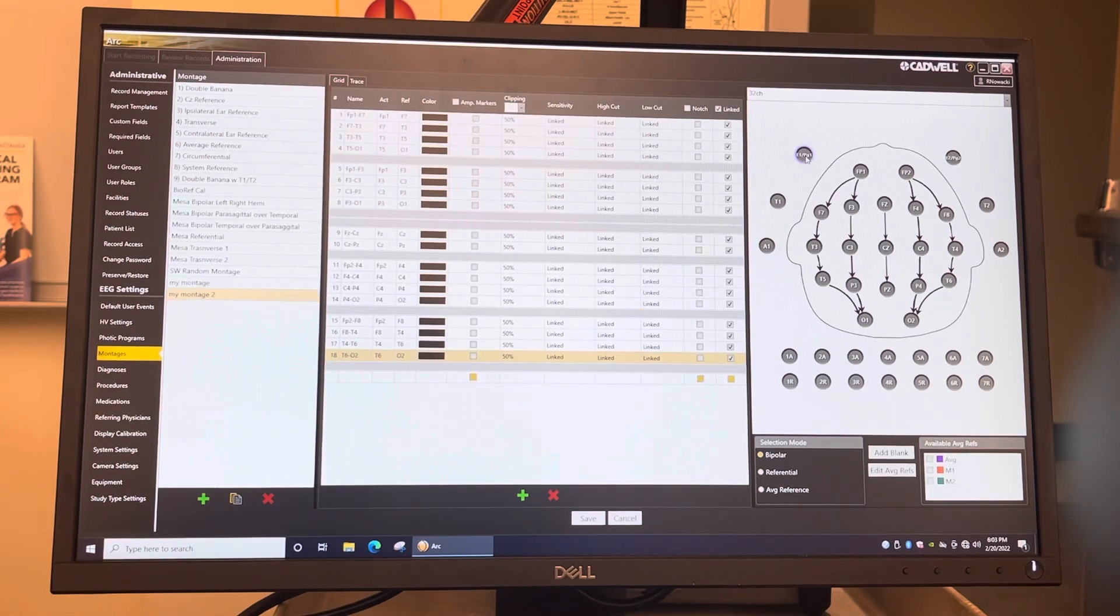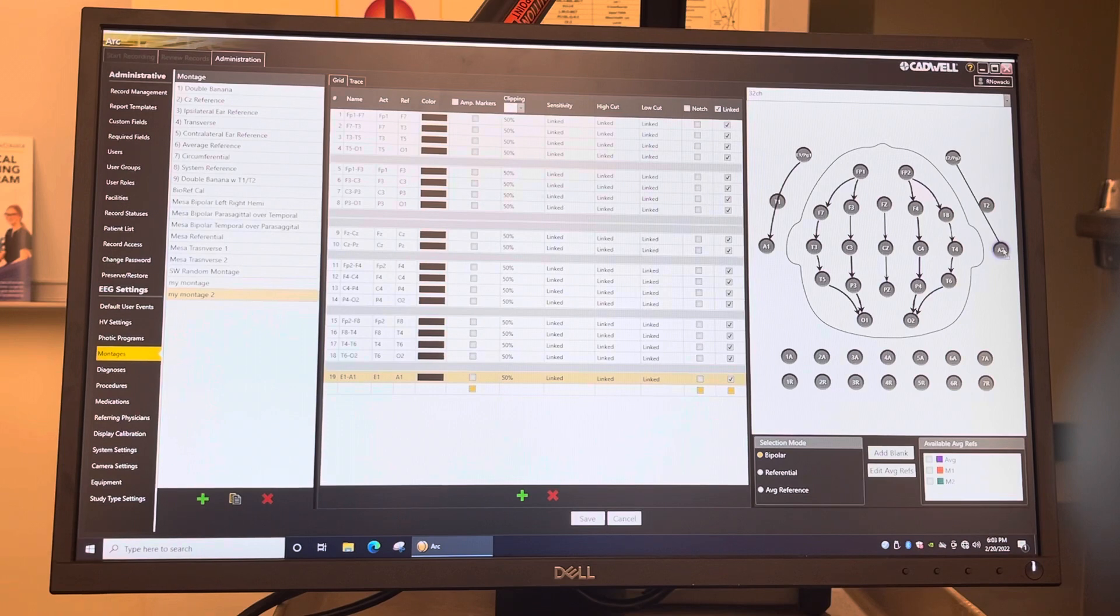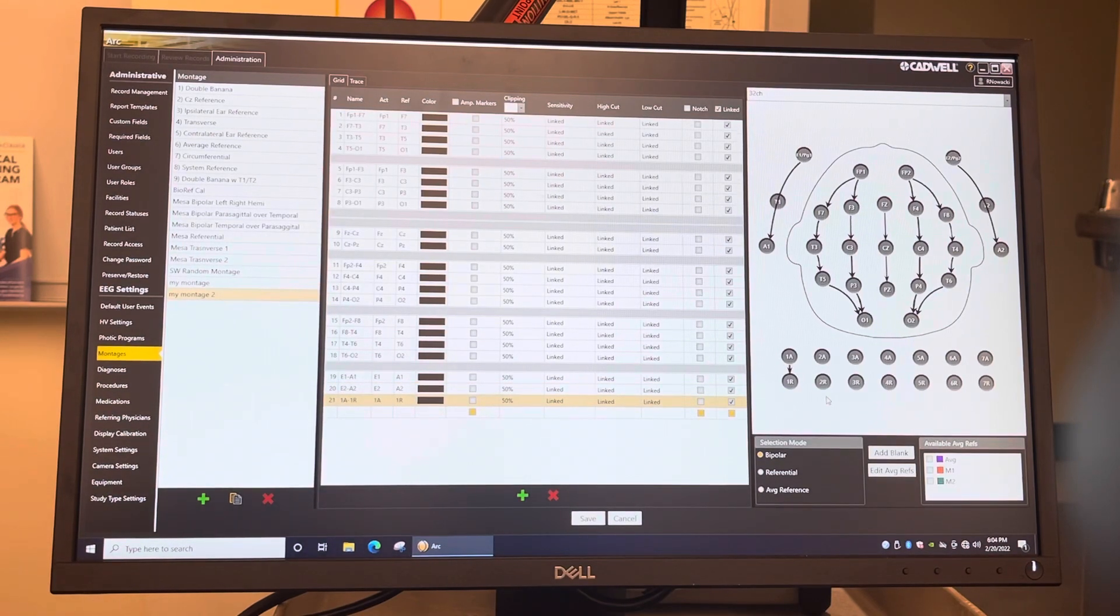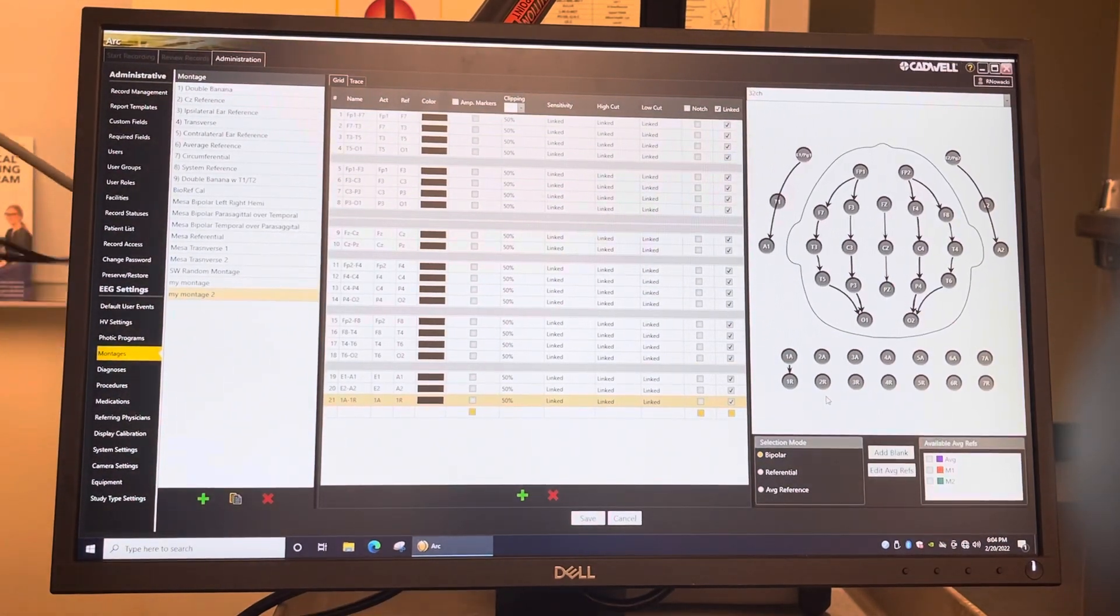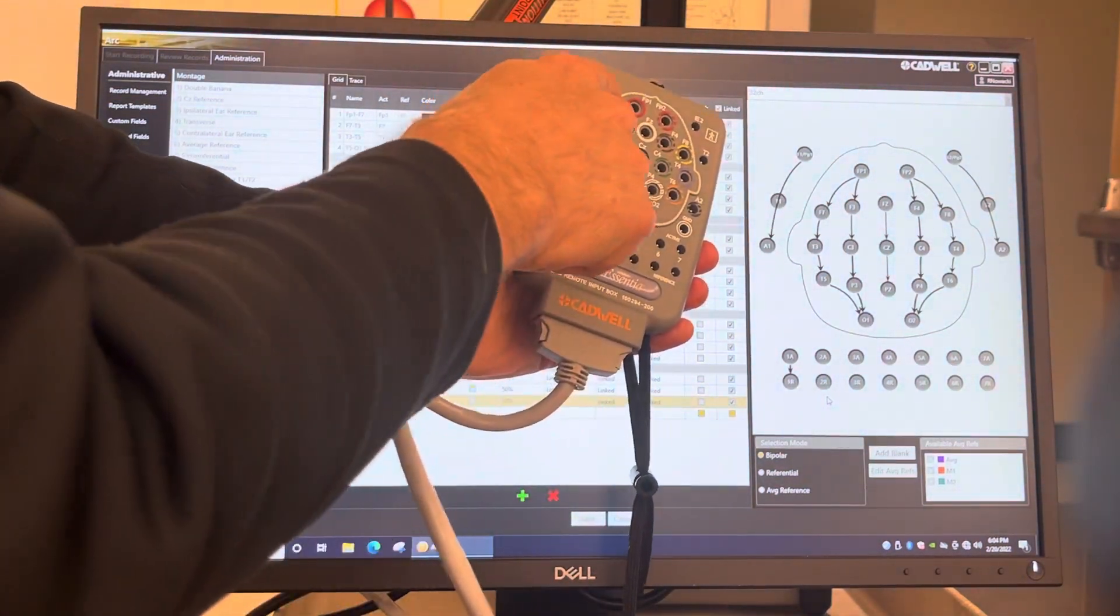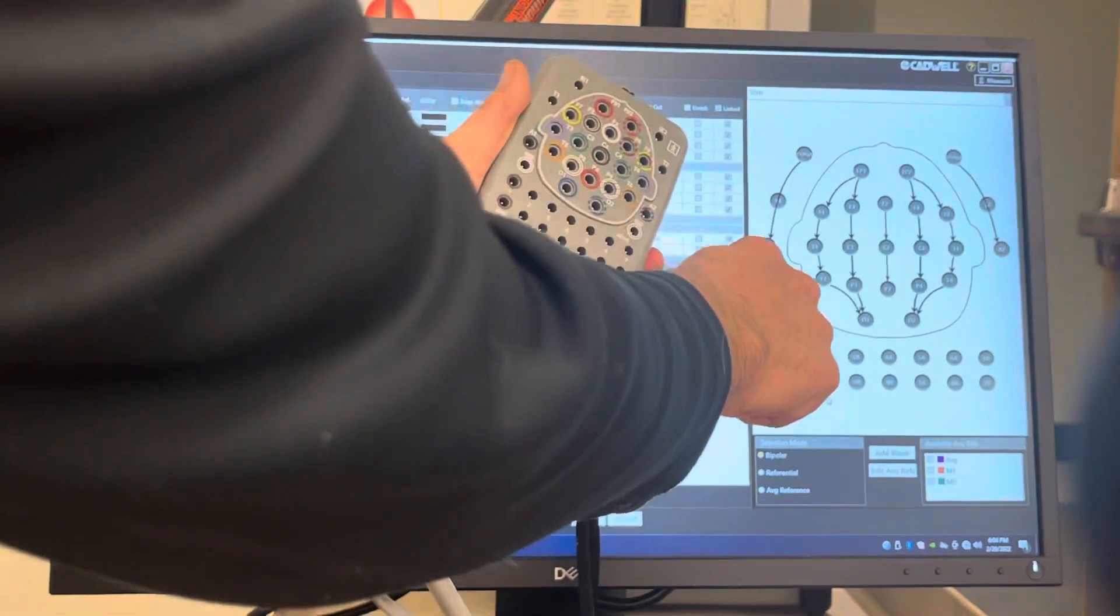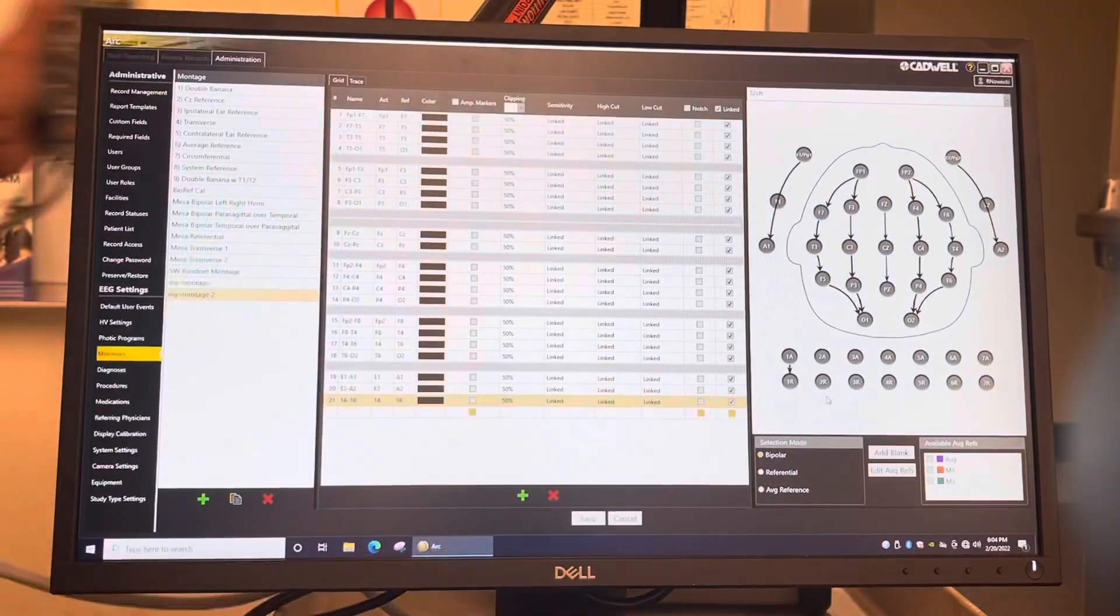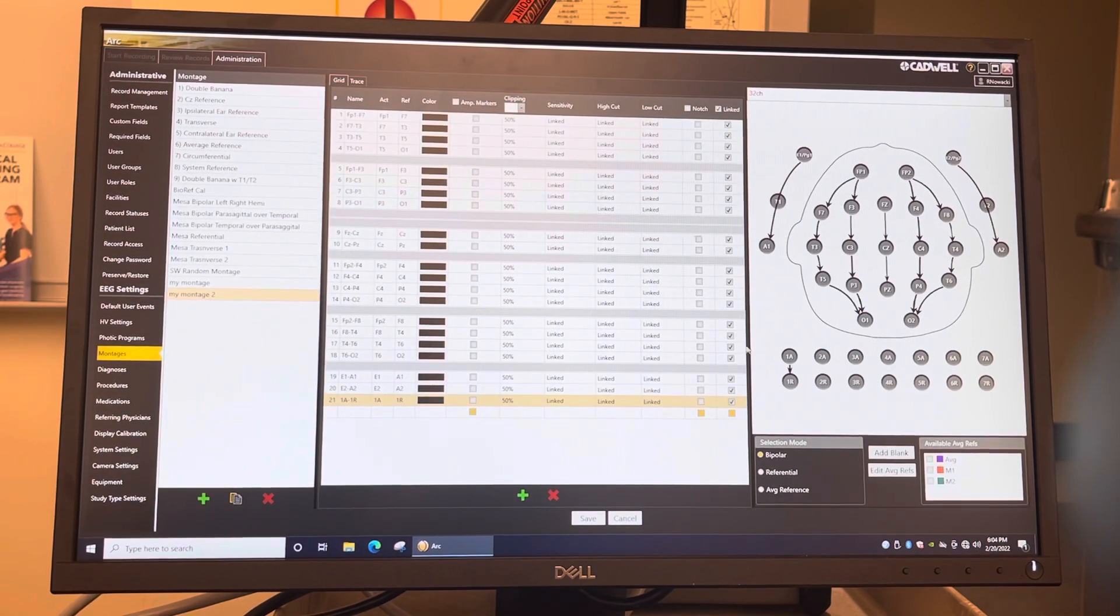If you remember in the Cadwell Jackbox, PG1 is the left eye, so that's going to be connected to A1. And PG2 is the right eye, so that's going to be connected to A2. And then in the Jackbox, 1A to 1R is the EKG. So let me show you that. So this diagram is the same as this. So I dragged the eyes here, E1 and E2, which is right here, and I dragged it to A1 and I drag that there. And then the EKG is right down here, so I drag that to that. So now everything's set.